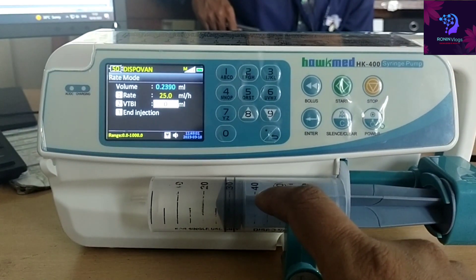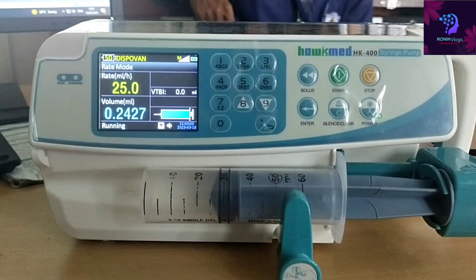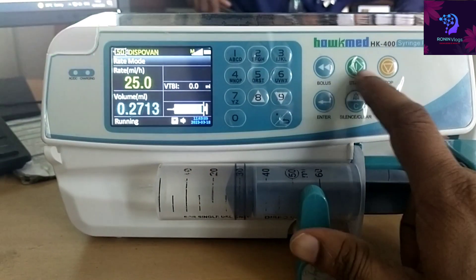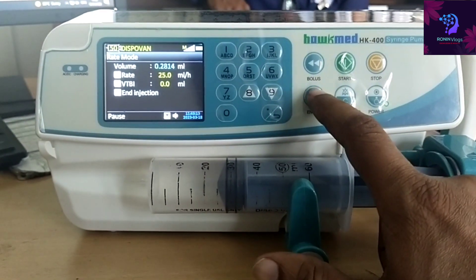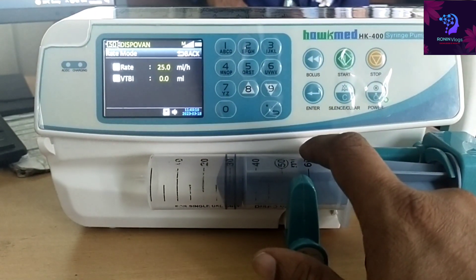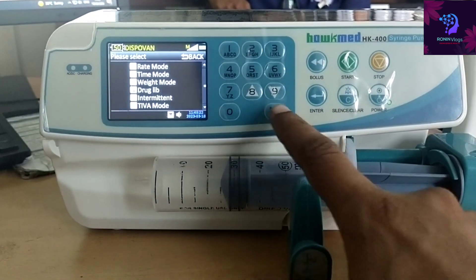Now I select the volume to be induced as 0 and start the process again. Since the volume to be induced is 0, the time will not be shown. Like this, it is easy to use. To go back, just press the back button and you can select any mode you want.